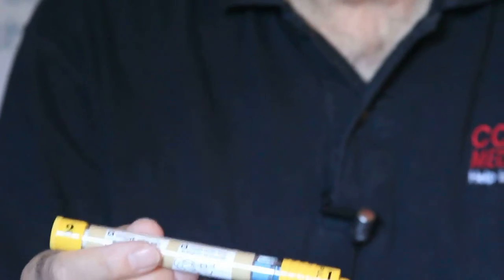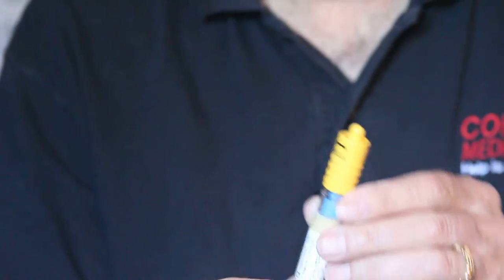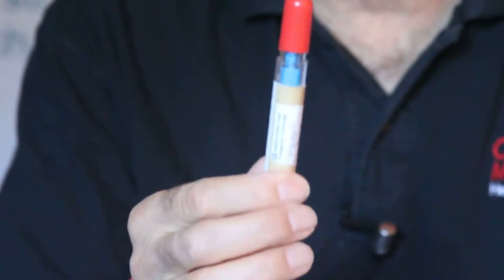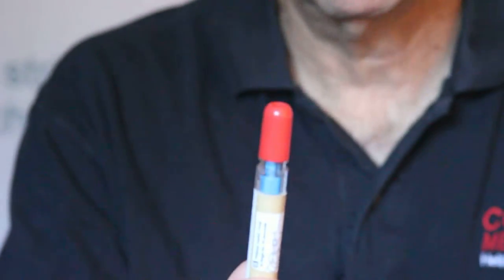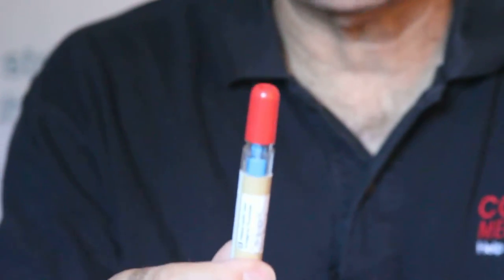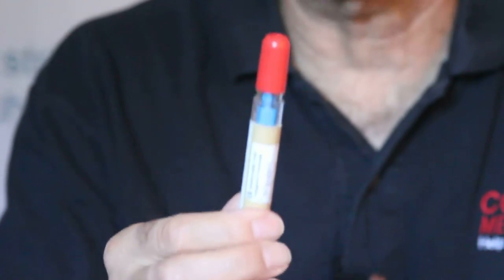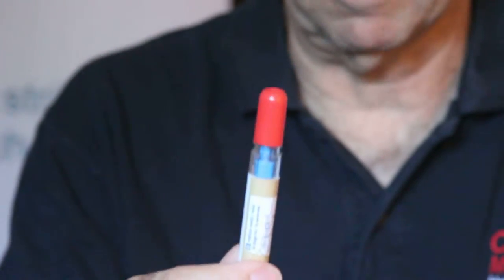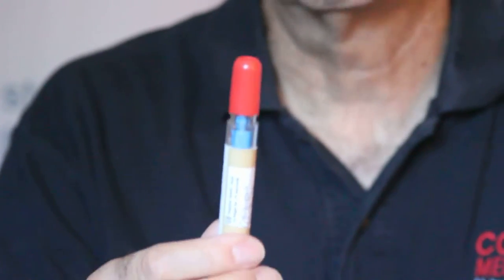So how do we use this? This one says pull, so the first thing we do is pull this off. This shows you the red injector tip of the pen — we never put our finger near there. If you accidentally stab yourself and inject yourself with epinephrine, you must go to the ER immediately because you could lose your hand for a year or forever. That's how serious this is.